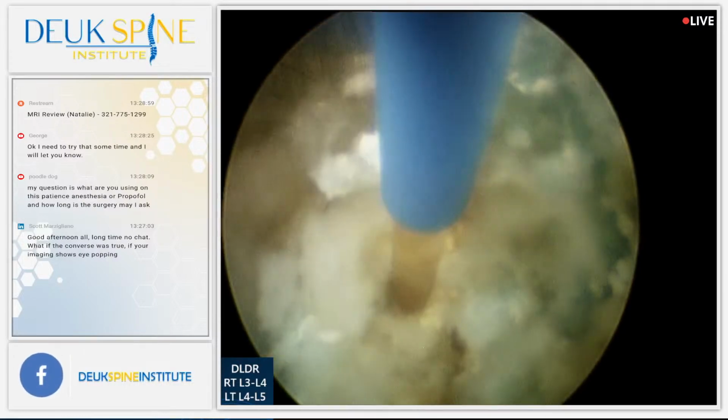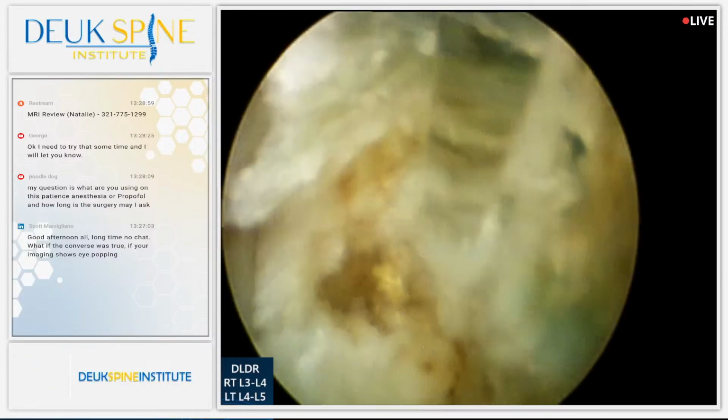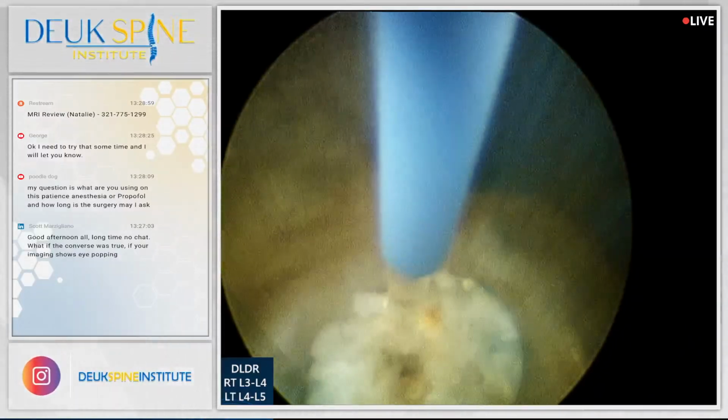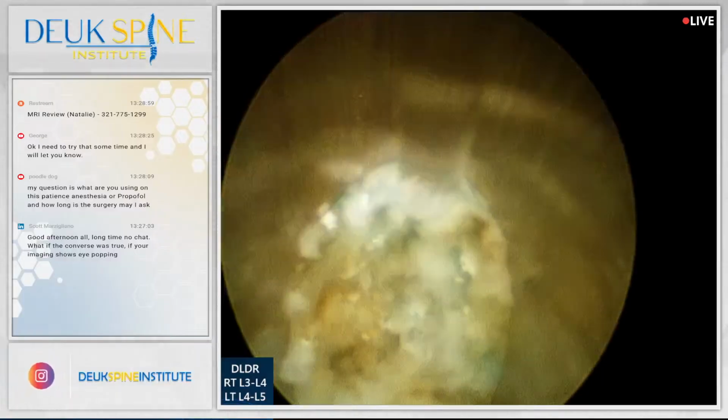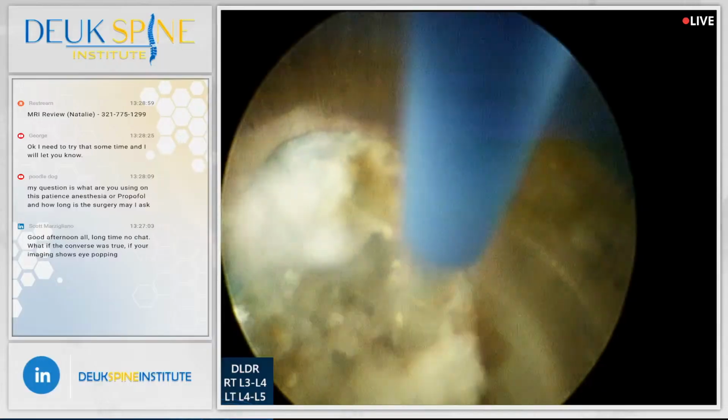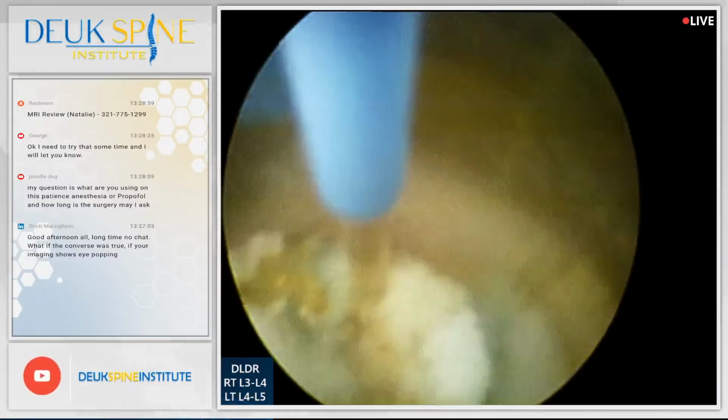I got 5 minutes. 5 minutes left. Dr. Berndes is wanting to know, for the patient's safety and anesthesia stuff, how much longer the surgery will be. I expect 5 minutes. Let's see what happens, but this is a big herniation here at L4-5.